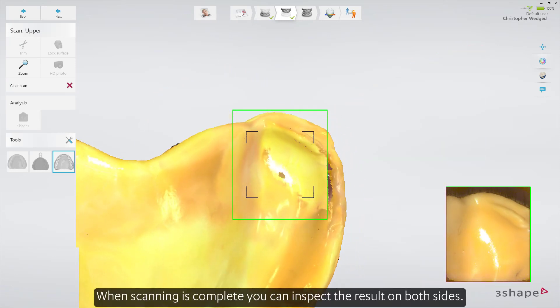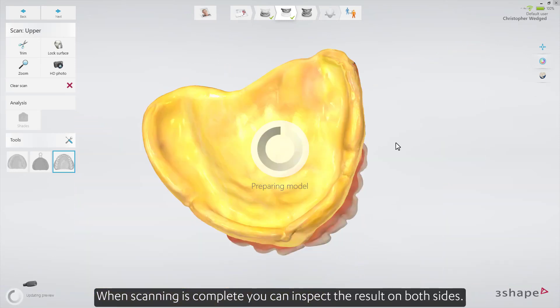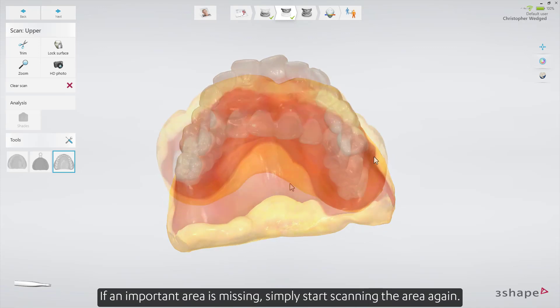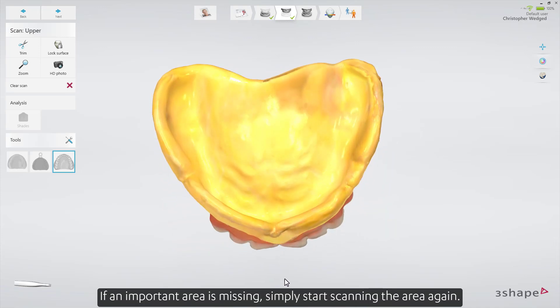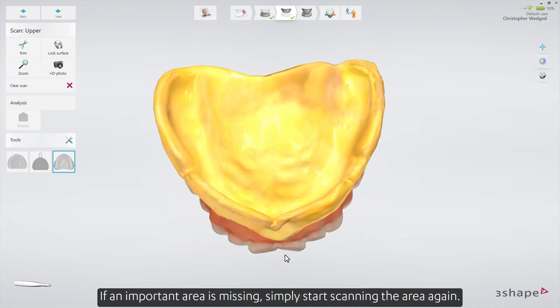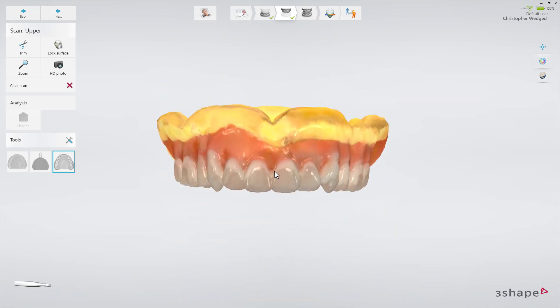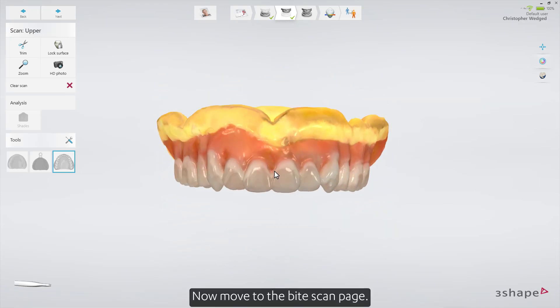When scanning is complete, you can inspect the result on both sides. If an important area is missing, simply start scanning the area again. Now move to the bite scan page.